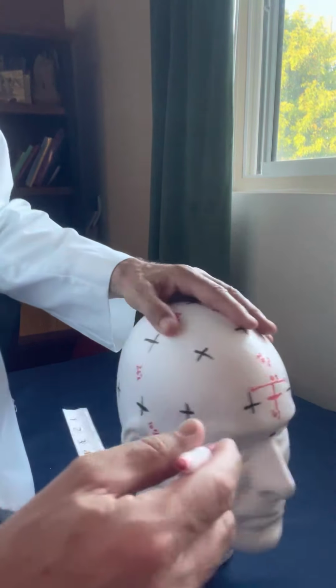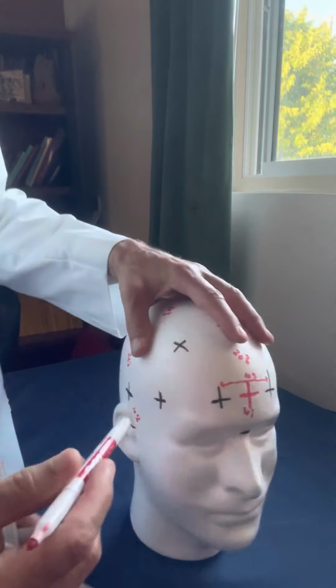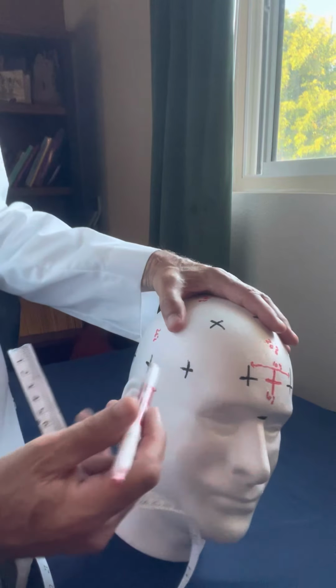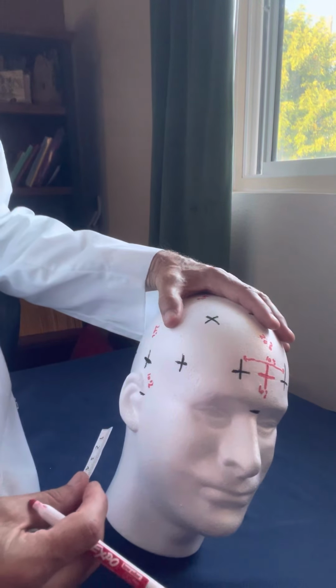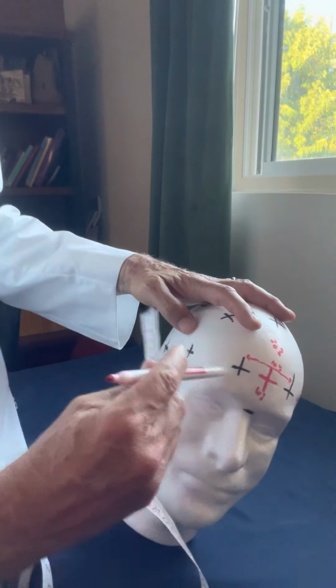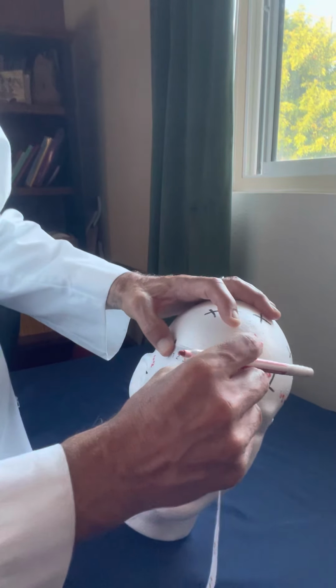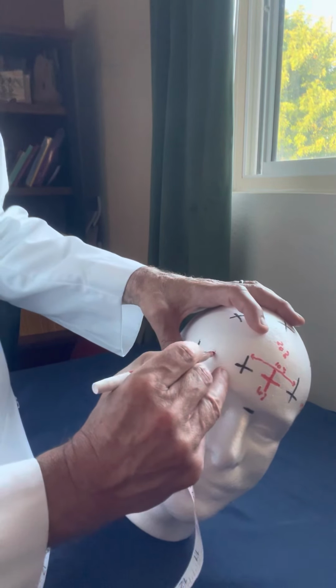Between each electrode on the circumference going around the head, the distance between each electrode is 10% of the circumferential measurement. If we go from FP2 to F8, it should be about 5.5. It's about 5.6, or 10%.